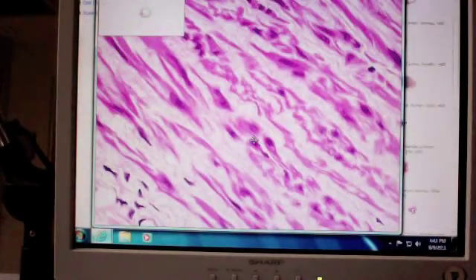All right, so if I said name this tissue, this is a tough one, be careful. Go through and look at this. First of all, what have we got here? Long flat cells in places, fairly large cells in places.